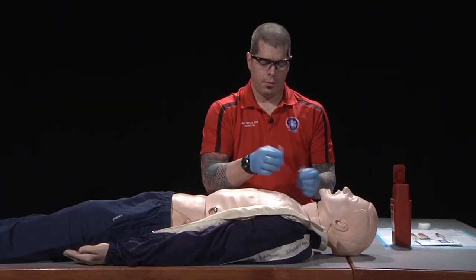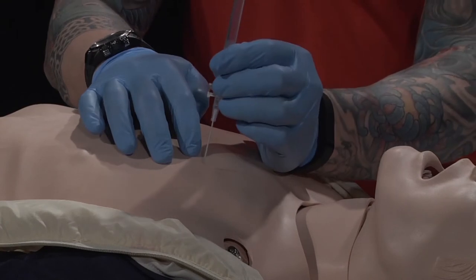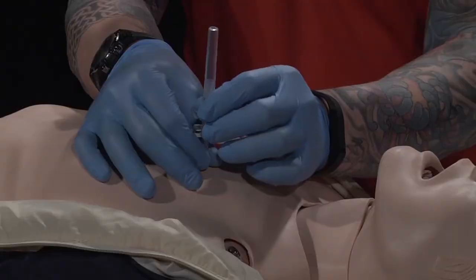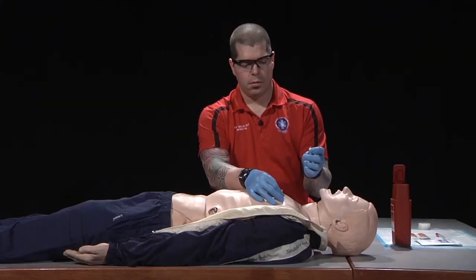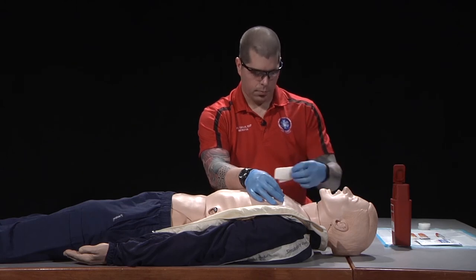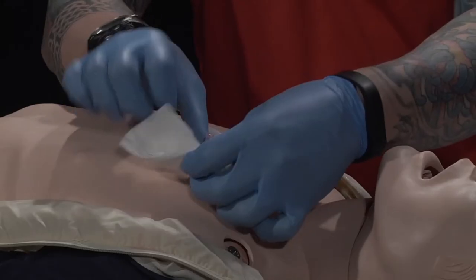Reconfirm the site, insert the catheter vertically over the top of the rib, listen for a rush of air, remove the needle, leaving the catheter in place, and immediately dispose of the sharps. Secure the hub with 4x4s and tape.